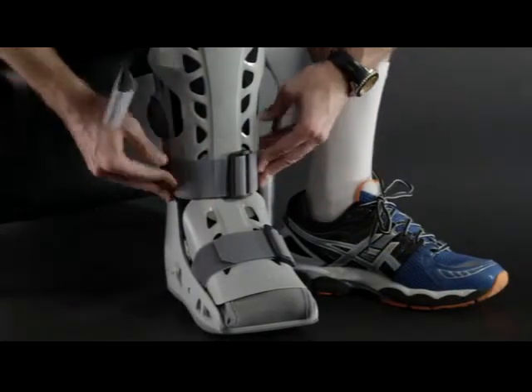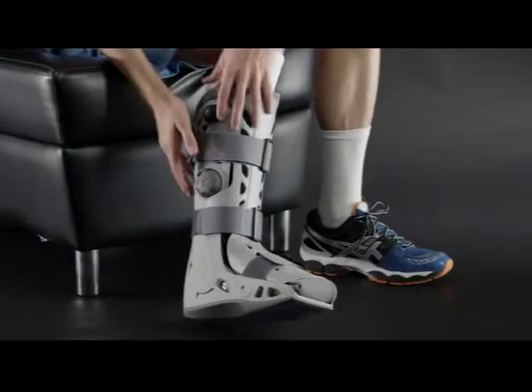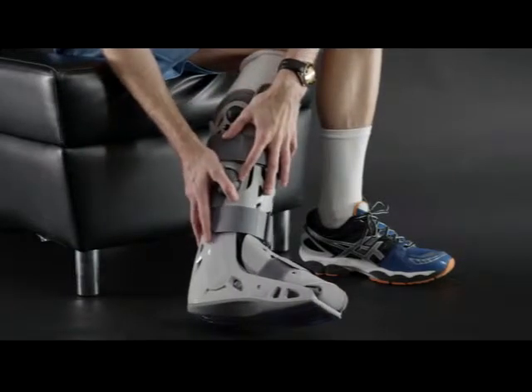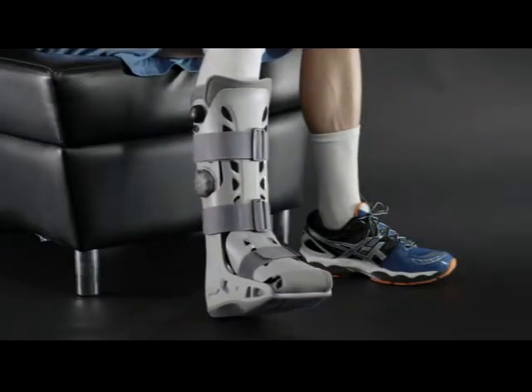To adjust the AirSelect Elite for a proper fit, you'll need to inflate the air cells. Begin on the injured side of your leg by locating the number on that side of the boot. To inflate each AirCell, turn the selector on the right side of the boot to the appropriate number.